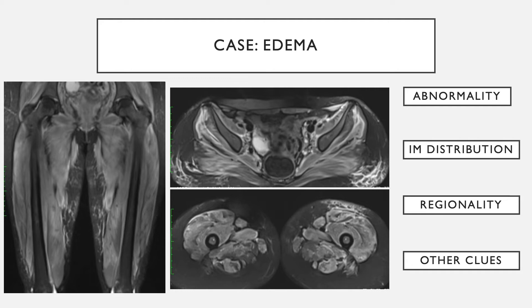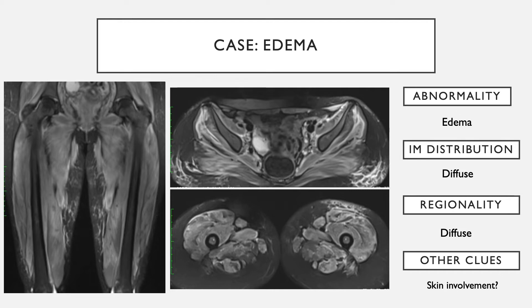In this first case, the abnormality is fairly diffuse muscle edema. The intramuscular distribution is diffusely involving the entire muscle, and the regionality shows all muscles are involved across the board. Looking carefully, there is also a little bit of edema in the subcutaneous tissues, indicating possible skin involvement. With diffuse muscle involvement and diffuse skin involvement, this is a case of dermatomyositis.